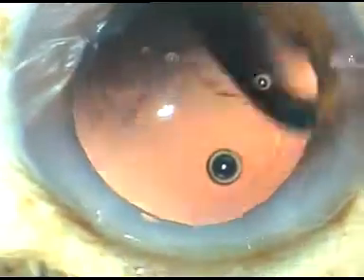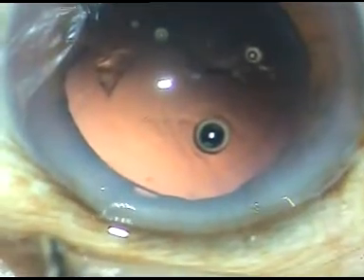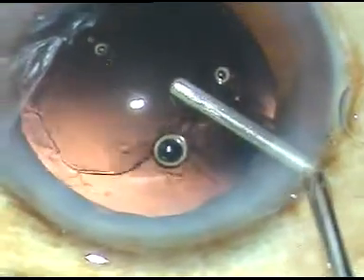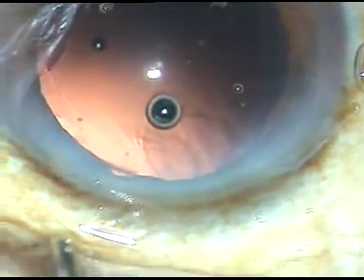And now is the time to implant an intraocular lens. HPMC is again injected. In this case, I have selected a hydrophobic acrylic single piece intraocular lens. The lens is loaded in the cartridge. Both the haptics should be on the anterior surface of the optic of the lens. The lens is advanced towards the tip.